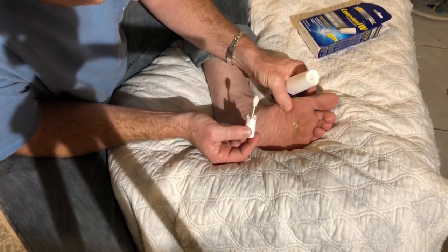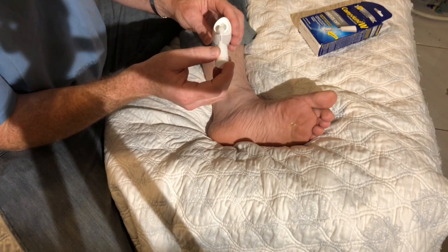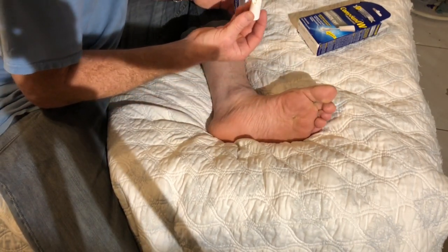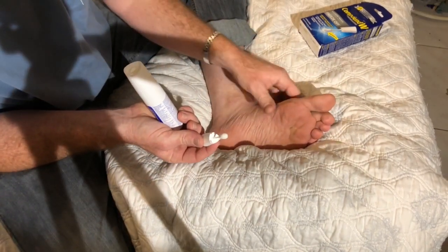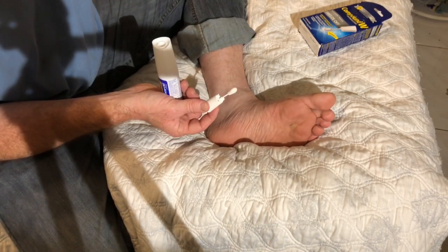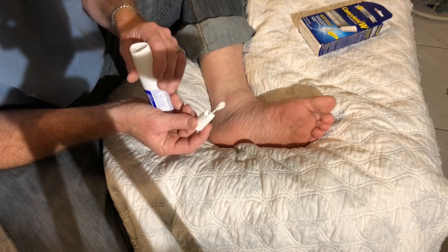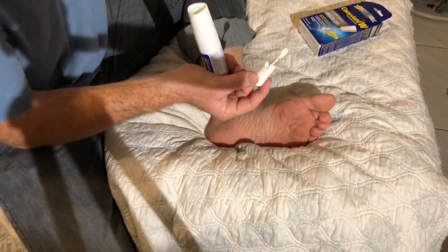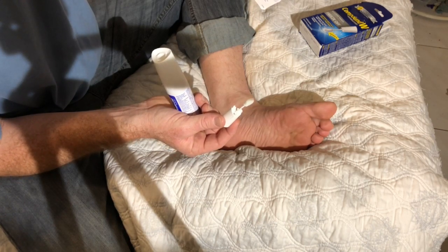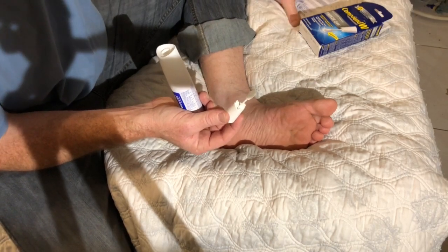That was a while. There are different times you can do it — as low as 10, 15, 20, or 40 seconds. I did 40, but you might want to start out at 20 seconds. You may not automatically want to do the full 40.